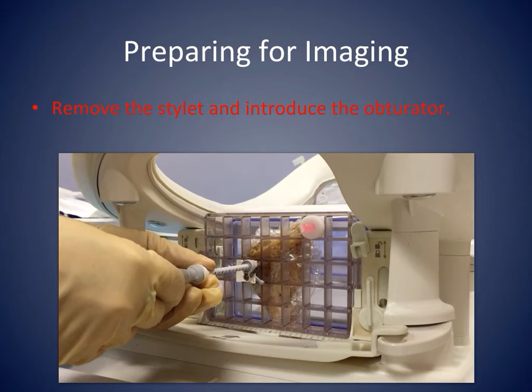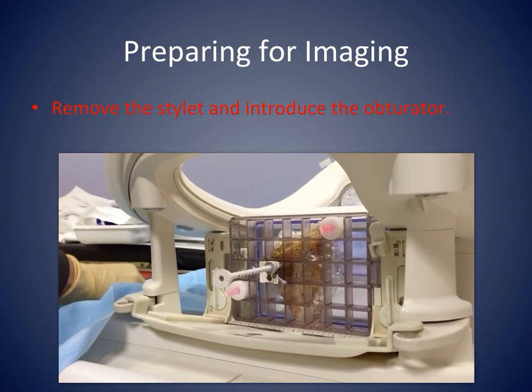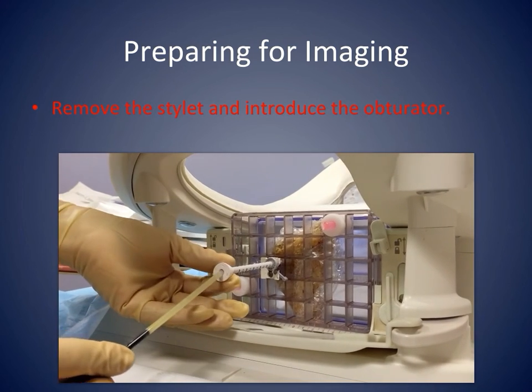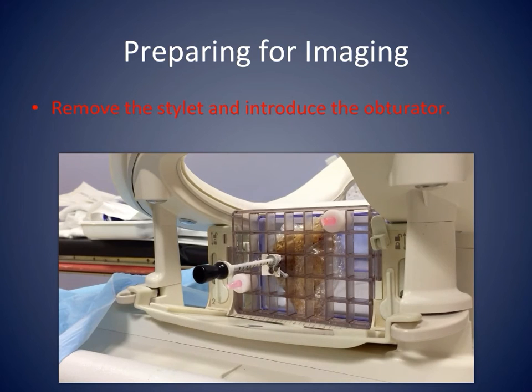Once the plastic introducer is inserted at the right depth, the stylet is removed and the plastic obturator is inserted within the plastic cannula. The patient is now ready for imaging.